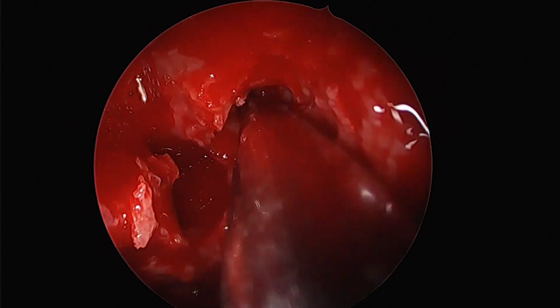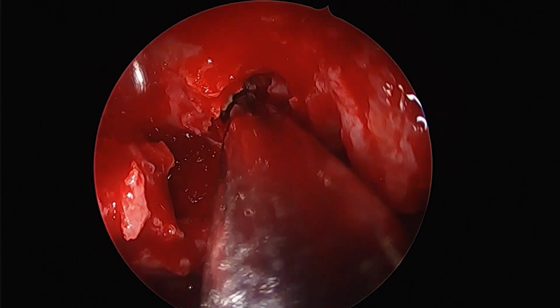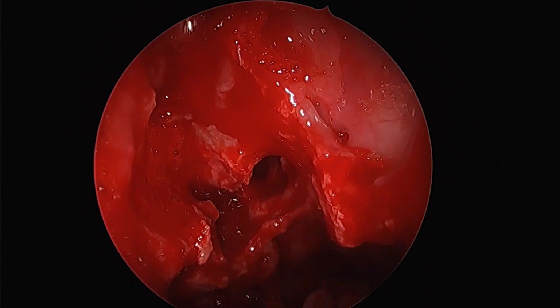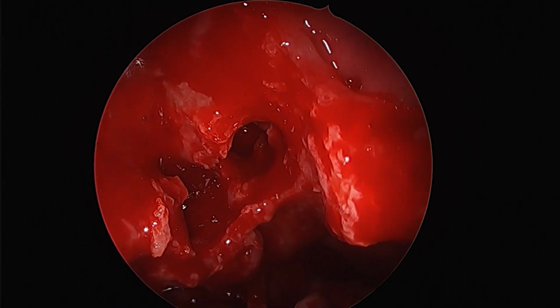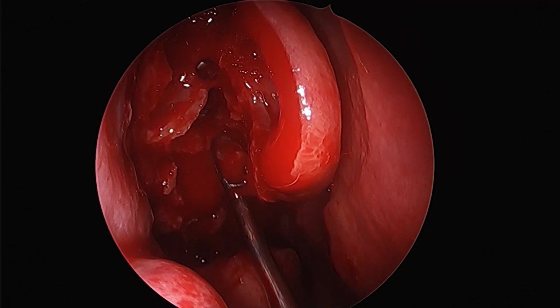And as we go inside the posterior ethmoids, what we see is presence of some kind of soft tissue which we are to discern and identify as to what is the very nature of it, because in a plain non-contrast CT we could only assess limited.